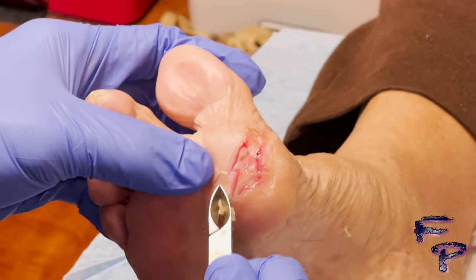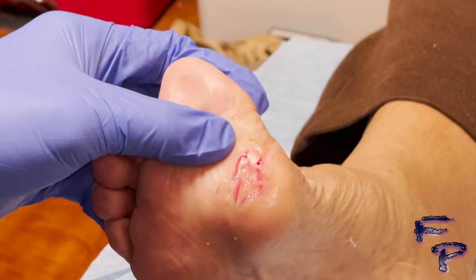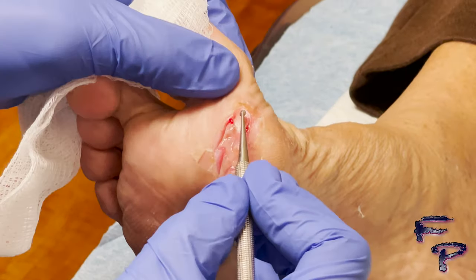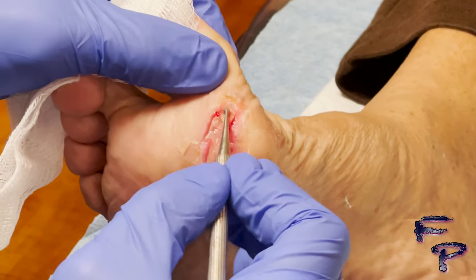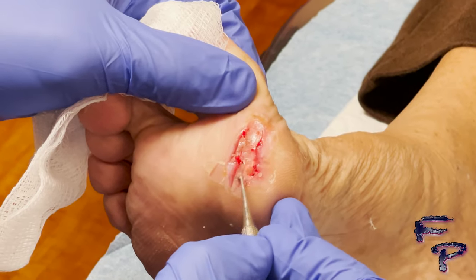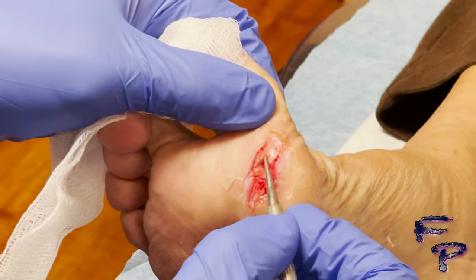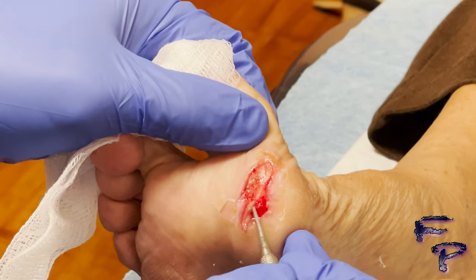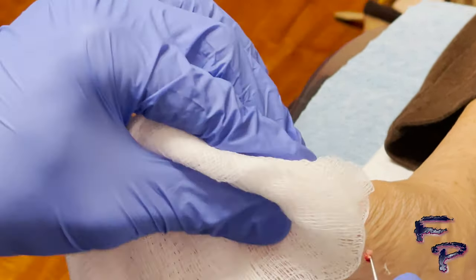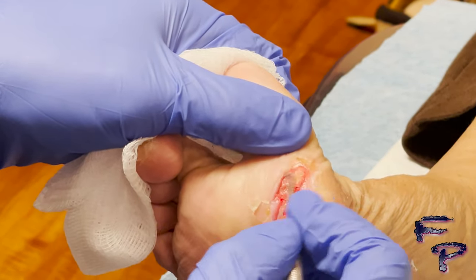Removing the remainder of non-viable skin, you can now see the biofilm on the surface of the wound, which you want to debride down to red granular tissue. This initiates the inflammatory cascade, which will assist with wound healing. You want to remove enough tissue to achieve red granular appearing tissue around the entire open wound.